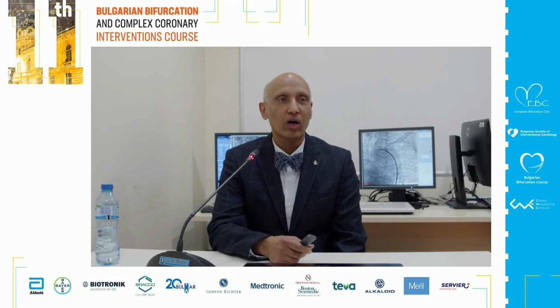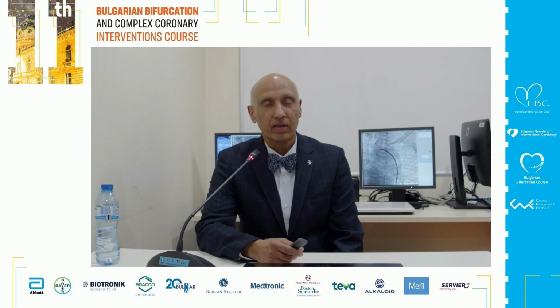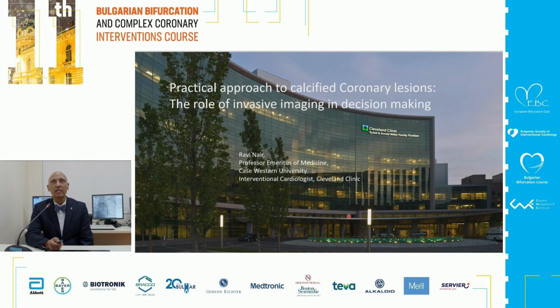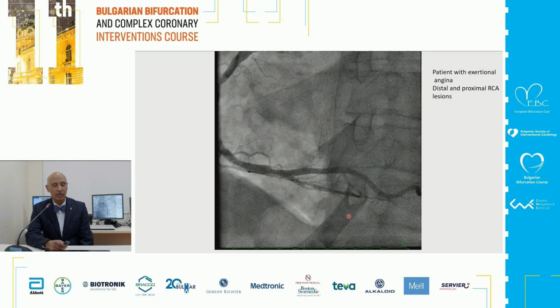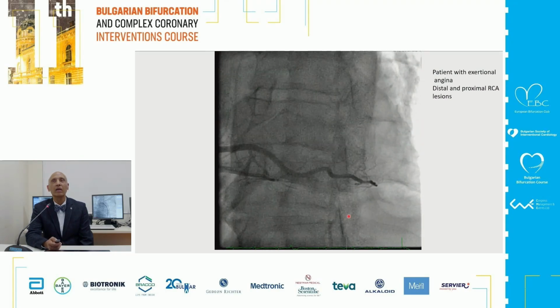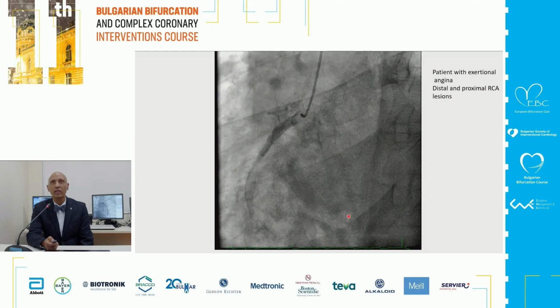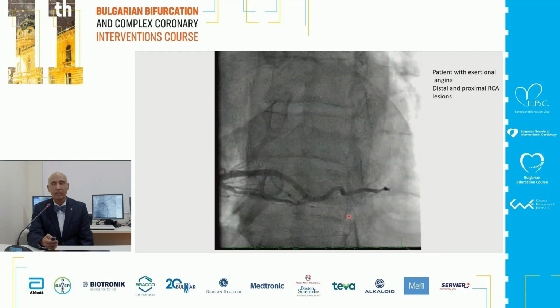So I'm doing an ad hoc presentation of the practical approach to calcified coronary lesions and the role of invasive imaging in the decision making and how we treat these calcified lesions. First, I would like to present a case that will illustrate certain things that I will be discussing very shortly. This is a very large right coronary artery, as you can recognize.